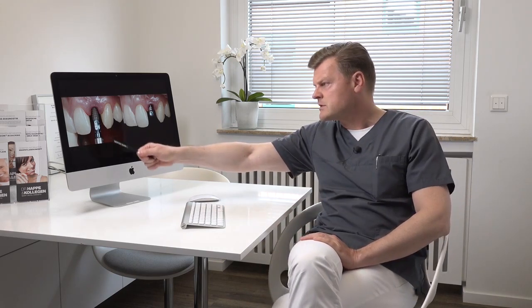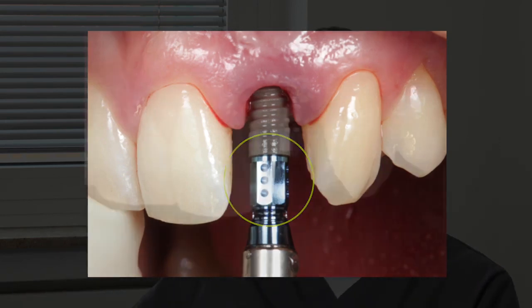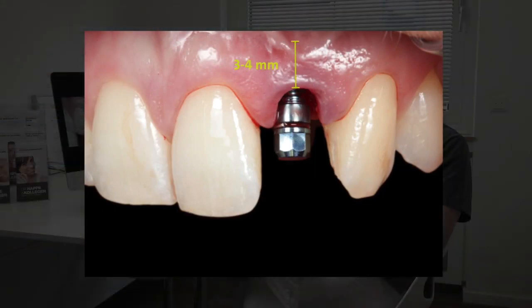Here you see the LOXIM, and you have control of the insertion depth with these little notches you can see on the picture. I always try to insert the implant 3 to 4 millimeters beneath the soft tissue margin I want to achieve.